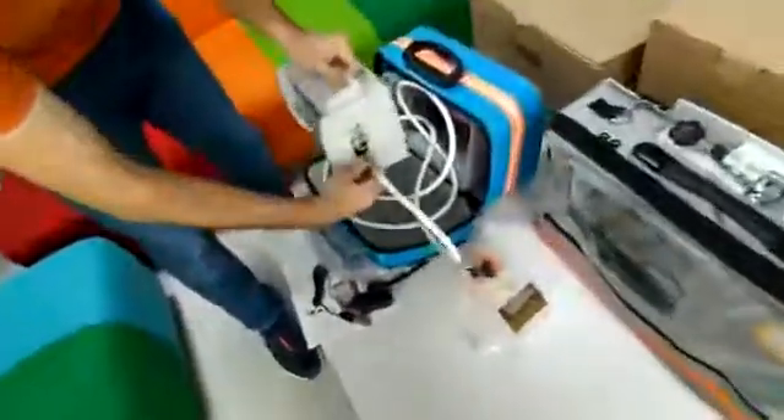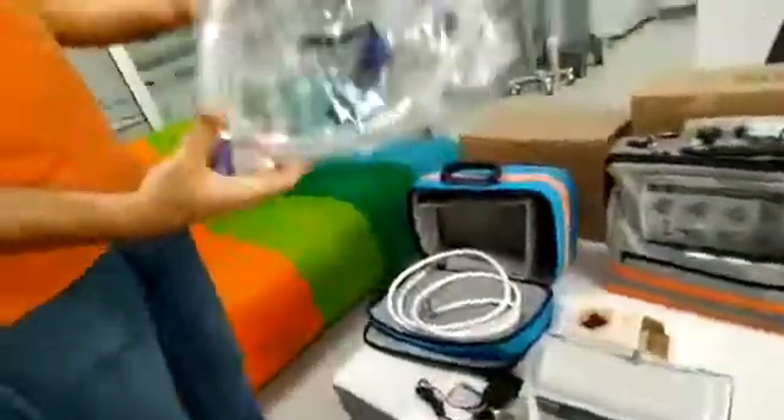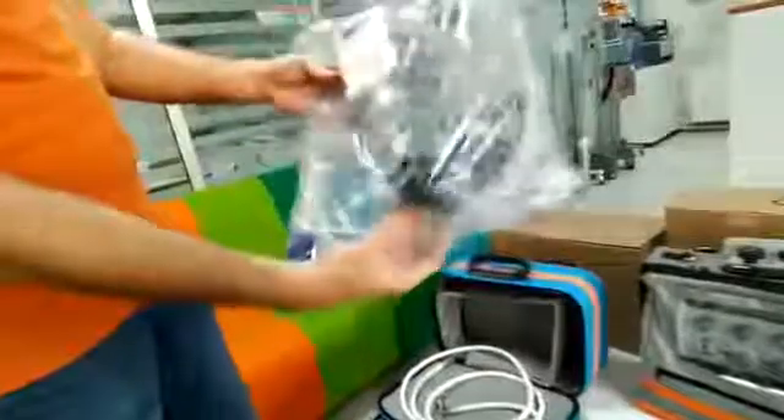And we have a patient circuit, and the exhalation valve here. This is our standard packing list.